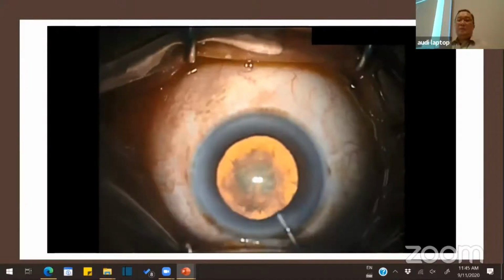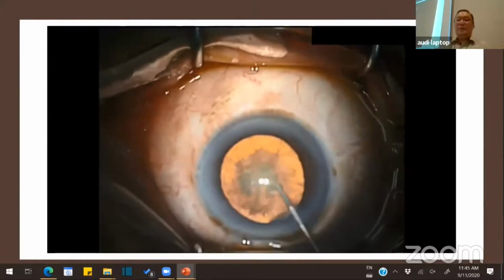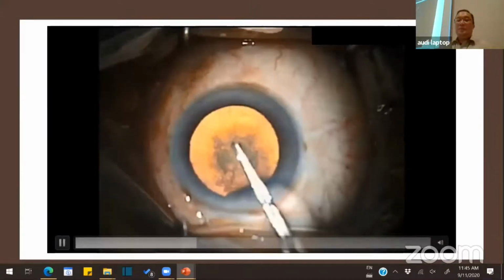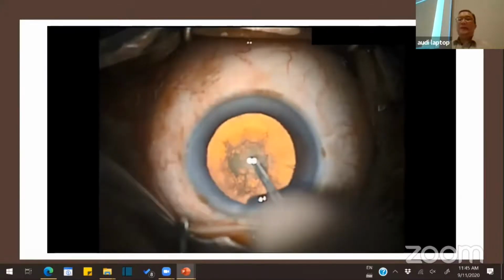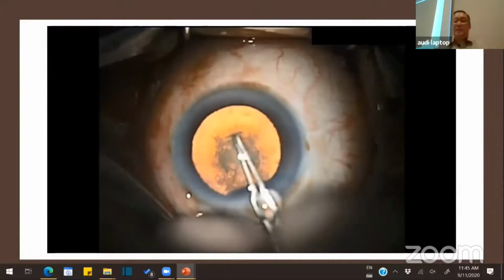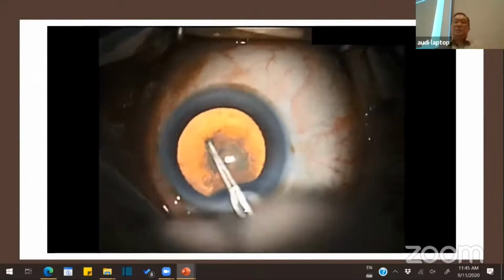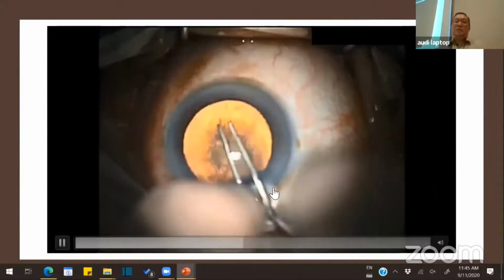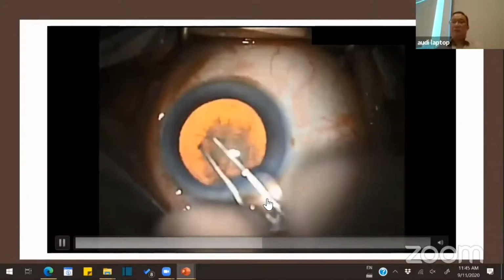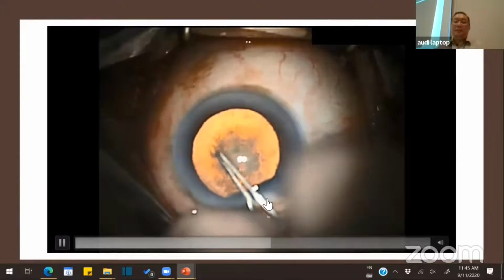So this OVD, you put it in right away to the center so that you will distribute properly. I don't use a bent needle. I use the sharp end of the Utrata to do the CCC. No vision blue. You can see the cortex, the capsule clearly.